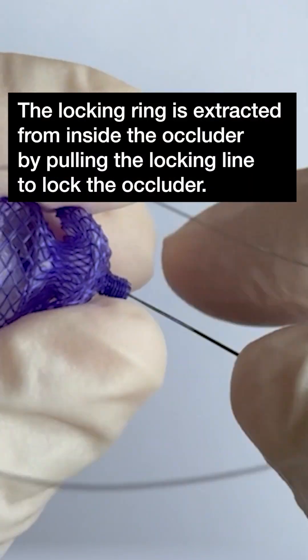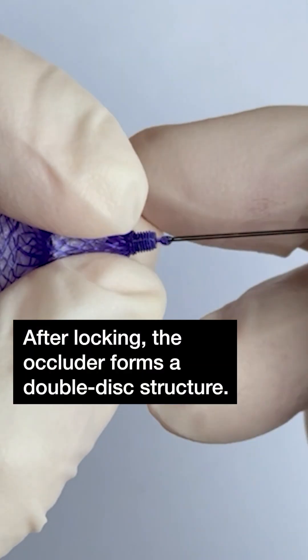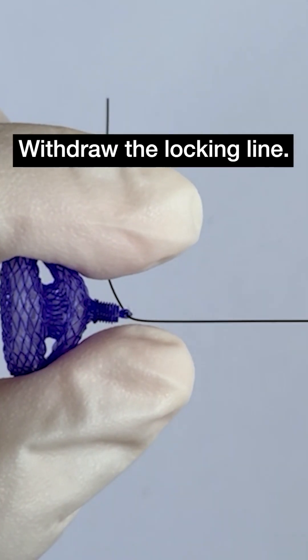The locking ring is extracted from inside the occluder by pulling the locking line to lock the occluder. After locking, the occluder forms a double disc structure. Withdraw the locking line.